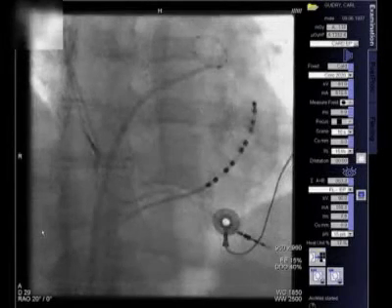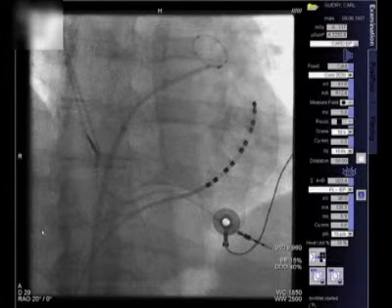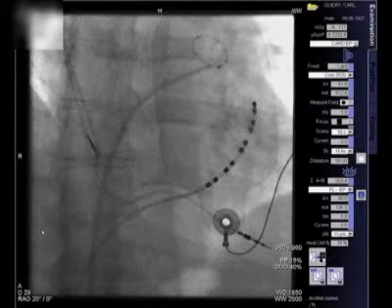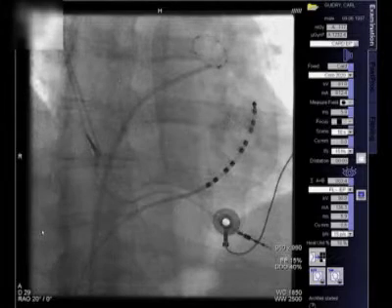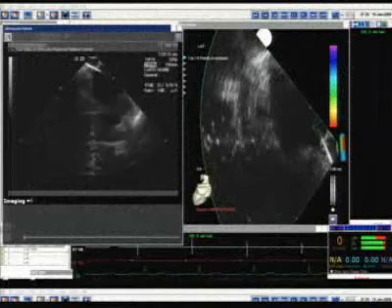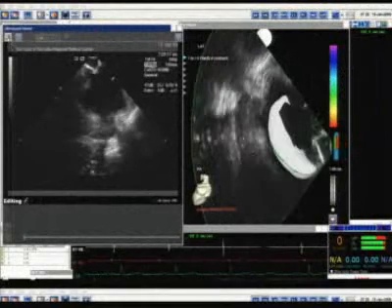Doctor, what is this in the lower right-hand quadrant of the screen? It looks like a stethoscope almost there. That is an electrode that is on the outside of the body, which is used to monitor the patient's heart rate during the procedure. We should point out the other electrodes there are pacemaking wires that the patient already had in. So the patient does have a pacemaker? That's a permanent pacemaker.